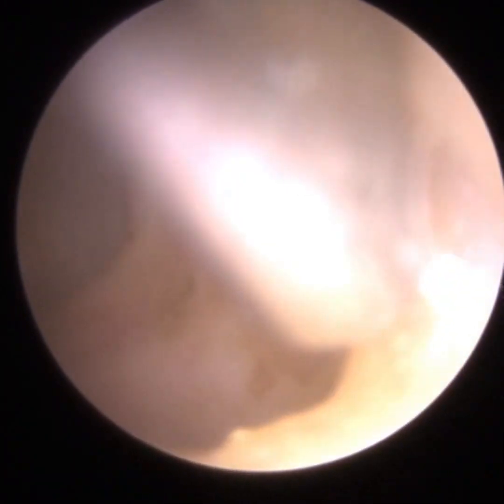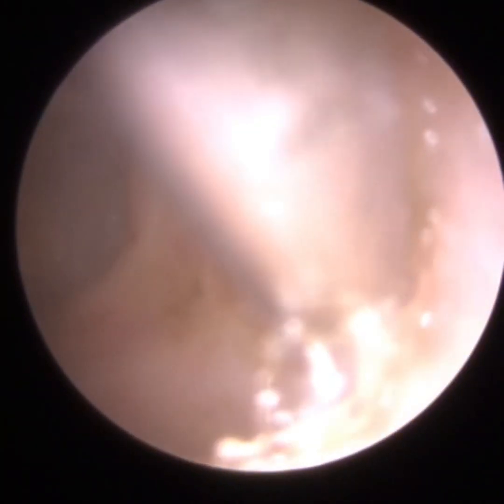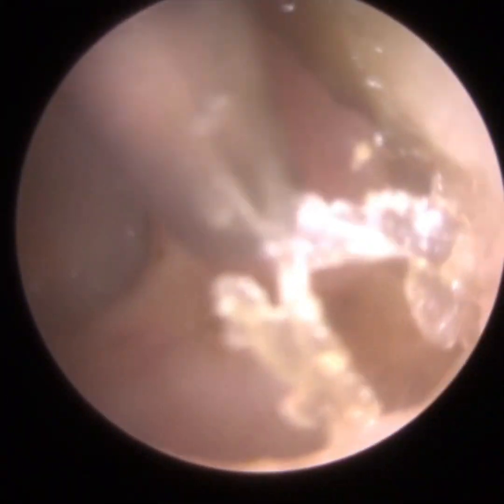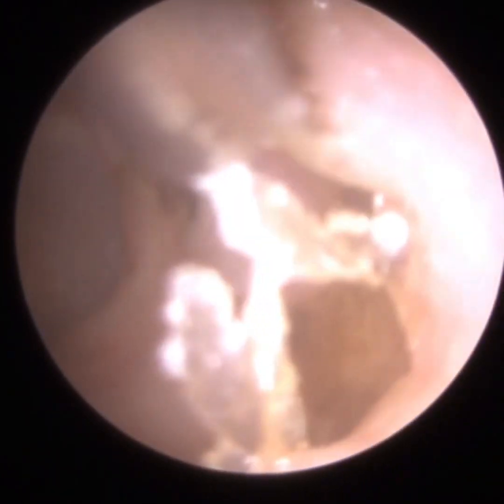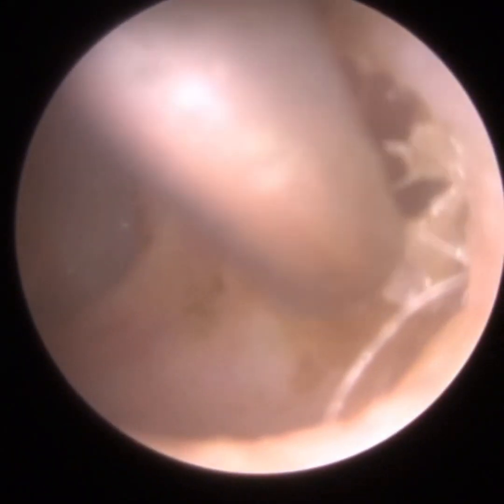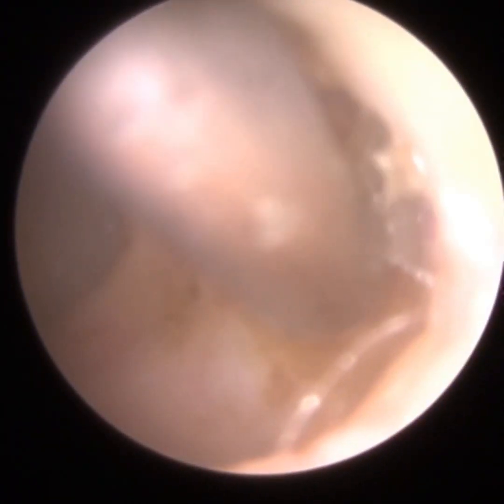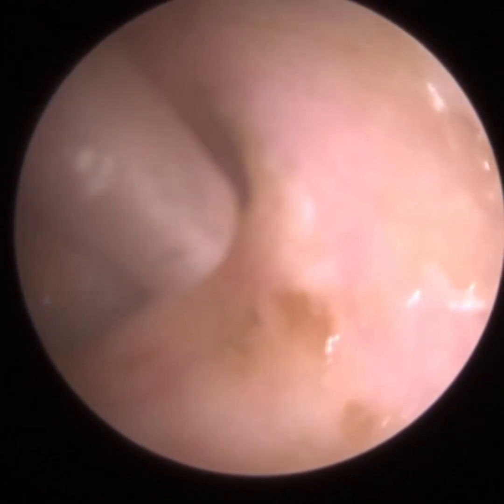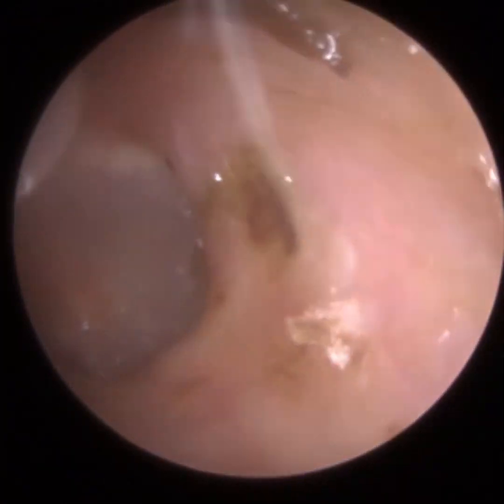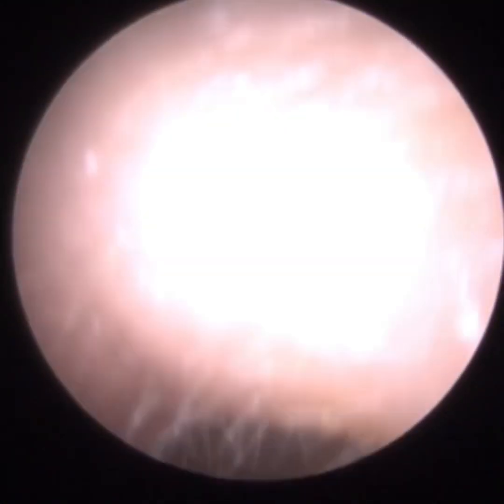Some people ask why you wouldn't just flush it out with water. Irrigation in the UK, or syringing as it was previously known, is no longer used as much, though some clinics still do. Irrigation has inherent risks. One of the biggest risks of ear irrigation or syringing is developing an ear infection, because water is really bad for the ears. Do not get water in your ear — I've said it a few times and will continue saying it.